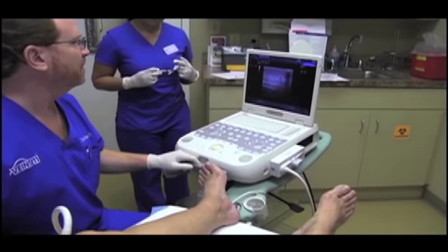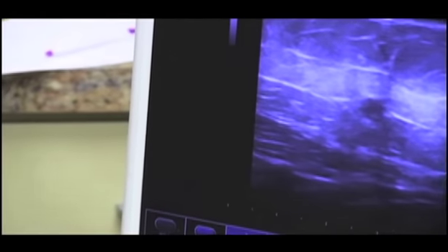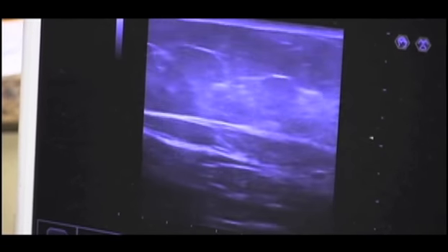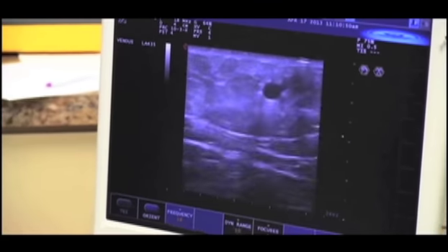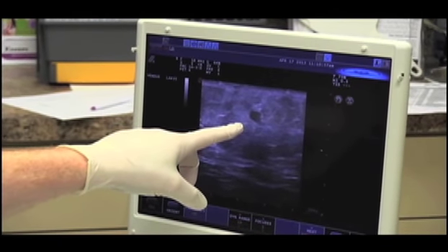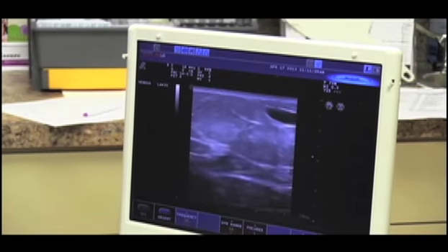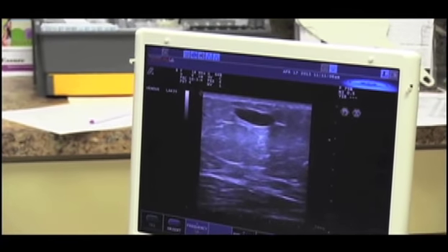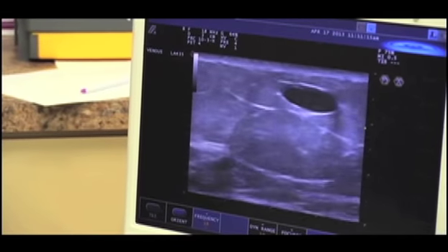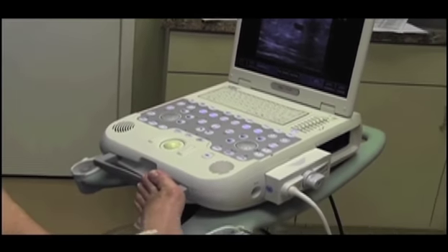We're just getting a lay of the land. I don't know if you can see on camera, but this is a saphenous vein we had previously closed just last week, so she's got a bit of a bruise there. She's already feeling better. Here we can see some branches coming off, and if we come down a little lower you'll see some very large veins. This is what I call 'winky winky' — that means it's an open vein. Without compression and then when I compress it, that vein just goes winky winky — it's open.